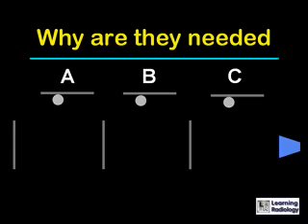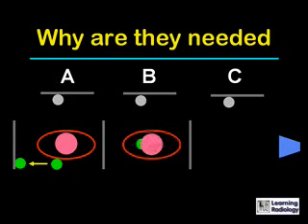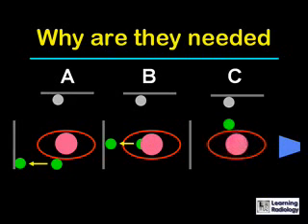And so we'll add another view at 90 degrees to the first, an orthogonal view represented by the vertical gray stripes. And in the case of patient A, we can see that the lesion is projected in that location on the X-ray cassette. Patient B, it's projected in that location, and patient C, it's projected in a different location.